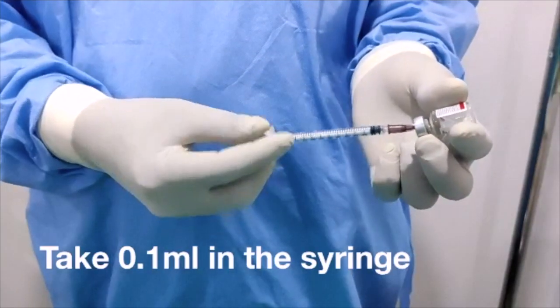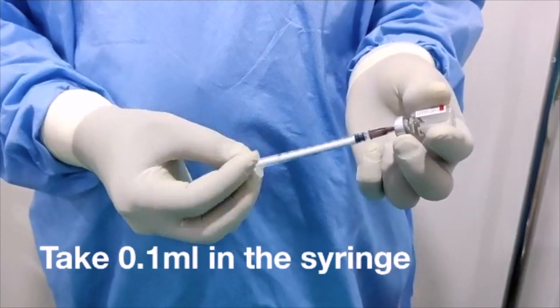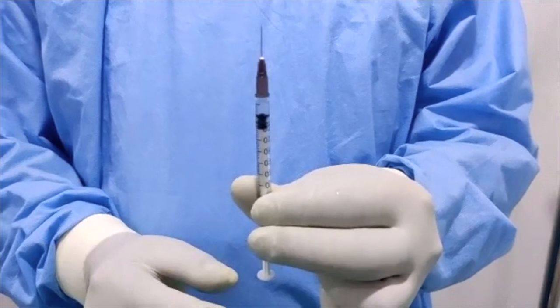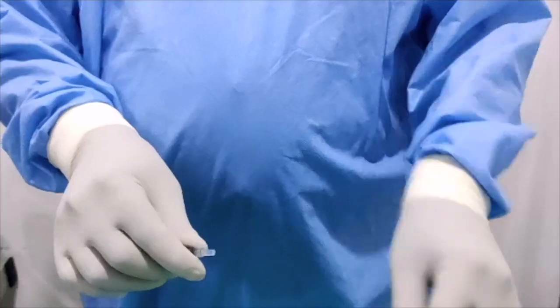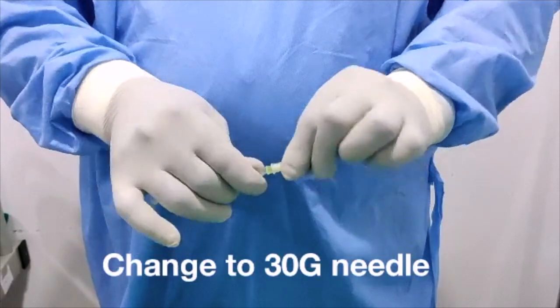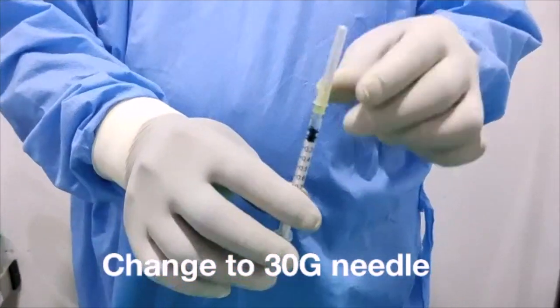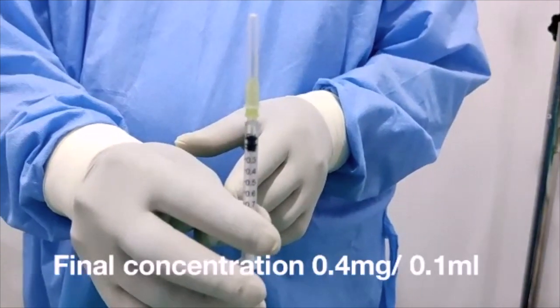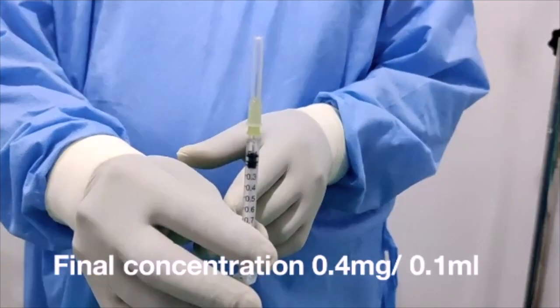Take 0.1ml from the dexamethasone injection. Change the needle from 26 gauge to 30 gauge. Now the final concentration is 0.4mg in 0.1ml and it is ready to use. Thank you.